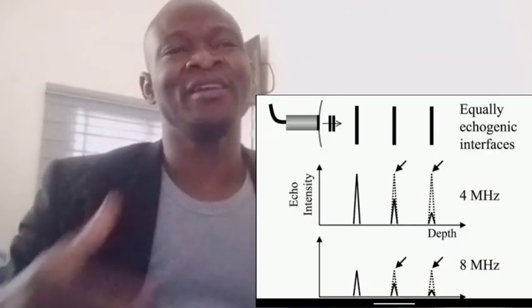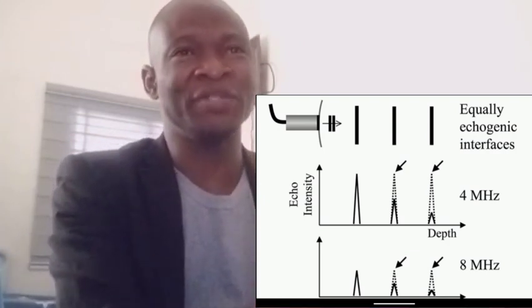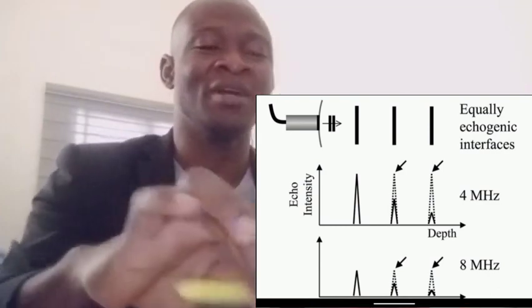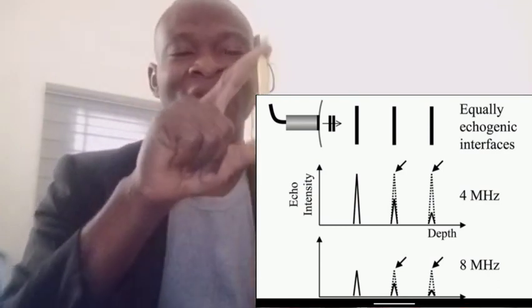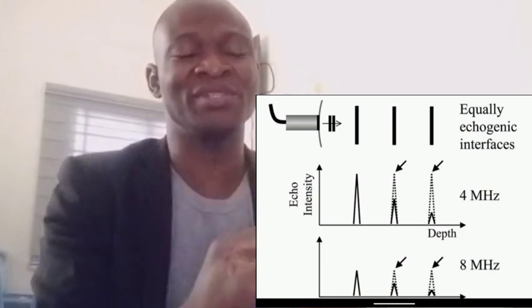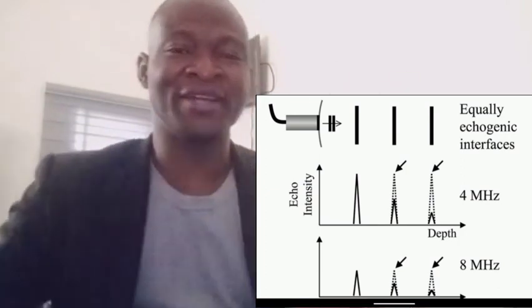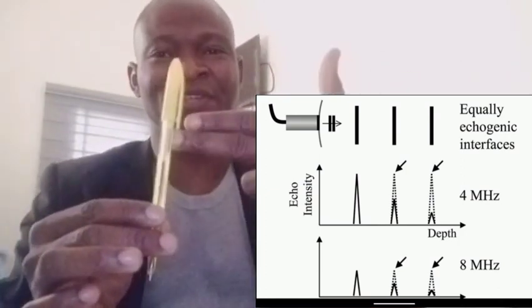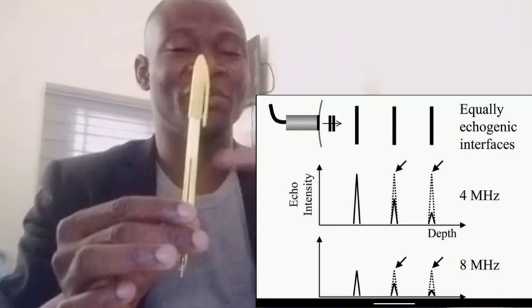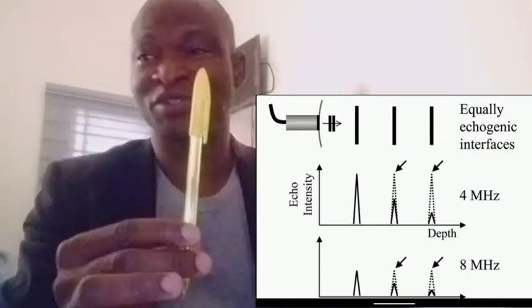So right here we have an image of the A mode. This is to actually give an idea. For example, you have your transducer on this end, and you have obstacles or objects of the same consistency, the same thickness and stiffness, three of them placed in an array, and we are passing the ultrasound wave through from the first to the last.